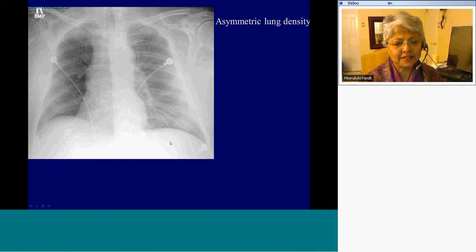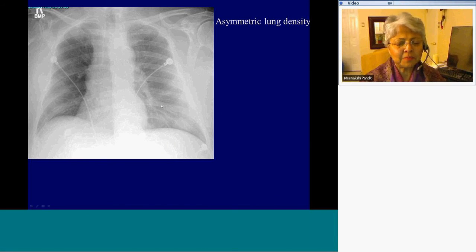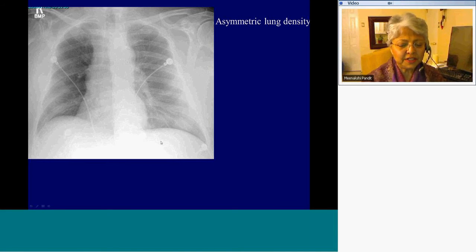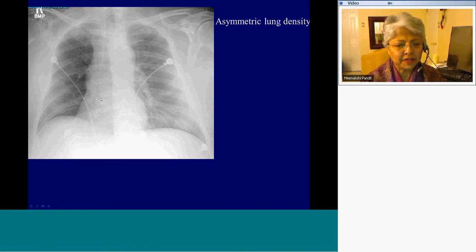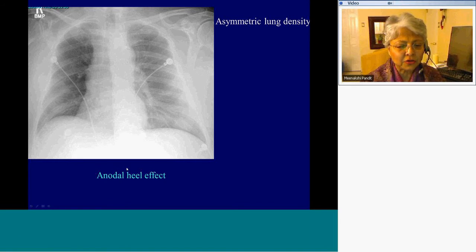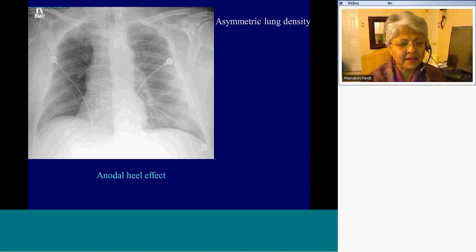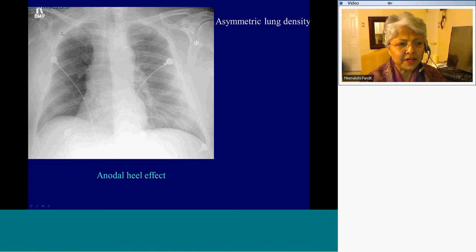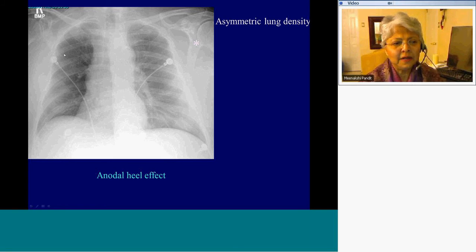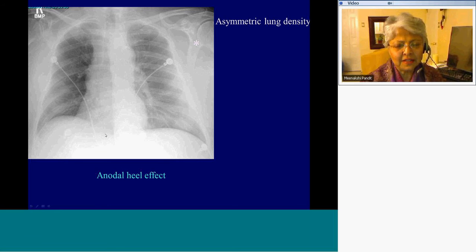The thing we should be aware of is asymmetric lung density. The various differential possibilities include layering pleural effusion in the supine position, asymmetric lung air trapping on the right, or partial collapse on the left. But more often than not, the asymmetry is caused by the anode heel effect — if the technician does not put the anode side of the X-ray tube towards the patient's head, it will result in this asymmetry. The way to tell this is technical is to compare the radiodensity of the soft tissues outside the chest wall — the left being denser than the right confirms it's a technical problem and not pathologic.